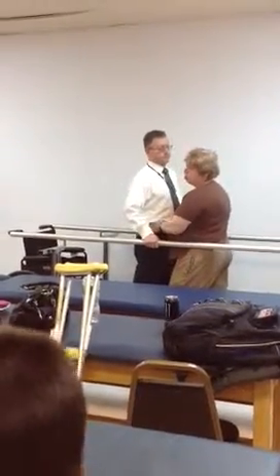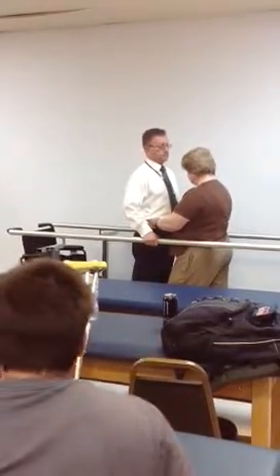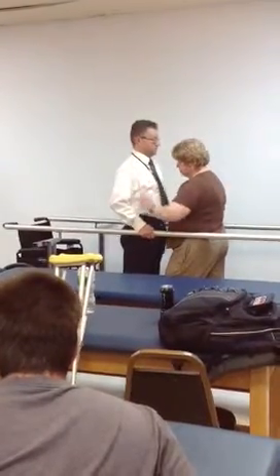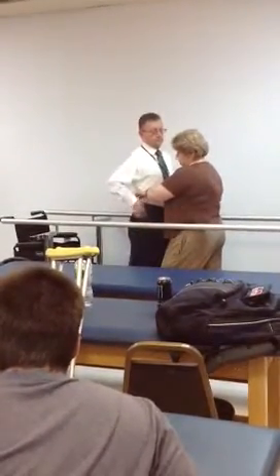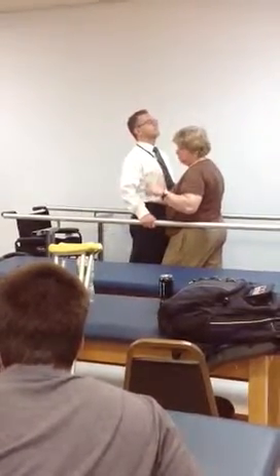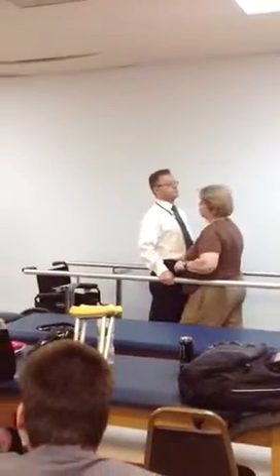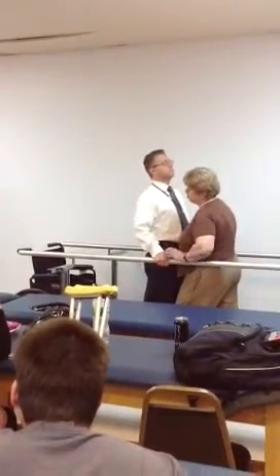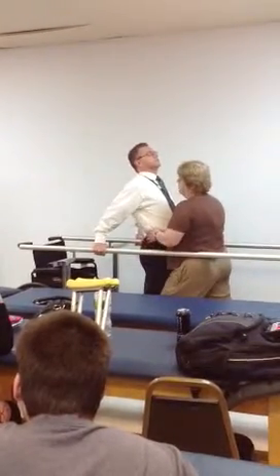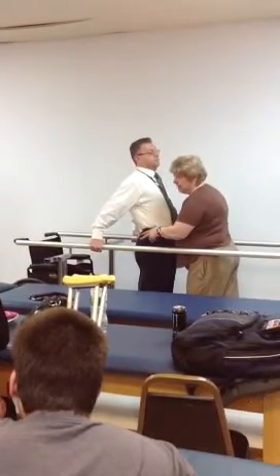And so what we're gonna do from here then is unlock one hip at a time, so shift your weight to one side. Okay, and then shift to the other side and keep your head back, okay? Now, this is much more precarious now, okay? So what you can do is keep your head back and reach your arms way, way back, as far back as you can go.